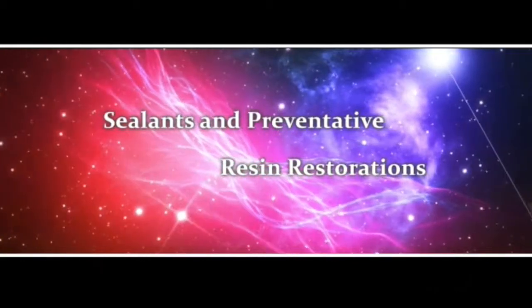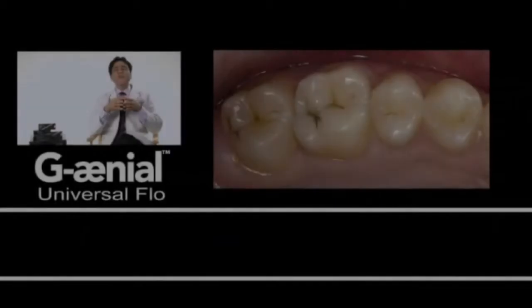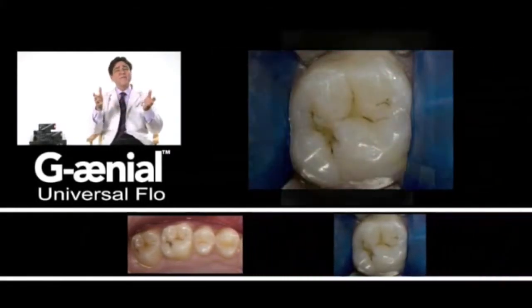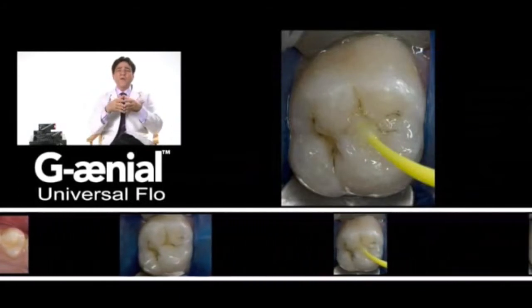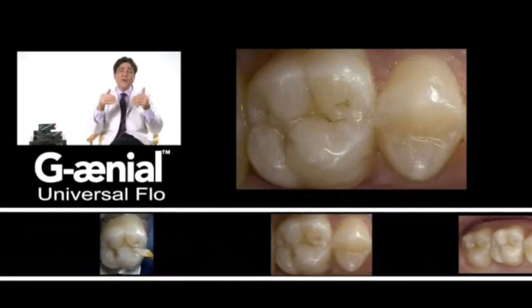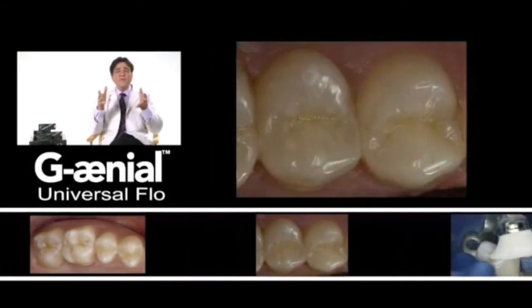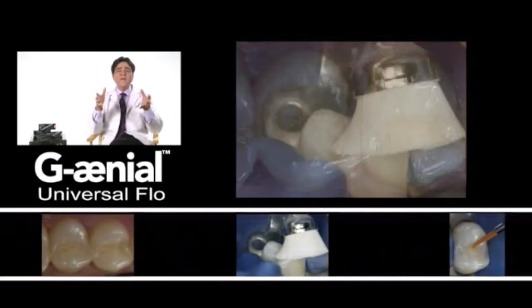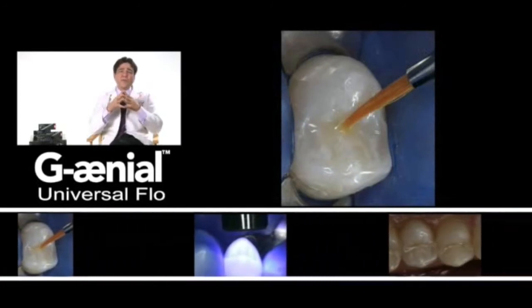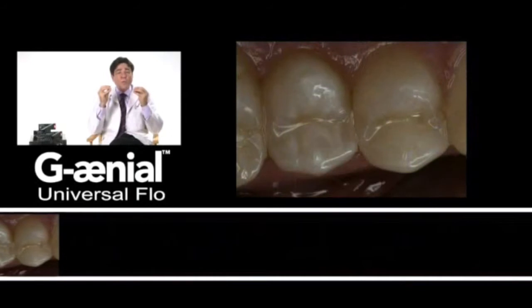As sealant and preventative resin restorations. Next generation flowables can be utilized as composite surface sealants, pit and fissure sealants, and preventative resin restorations. These highly filled nanomaterial formulations can be cured in a thin film and have the potential to increase the wear resistance of posterior composite resin restorations, since the interparticle spacing is reduced and the filler particle density is increased, and thus can provide more reinforcement and protection of the resin matrix.